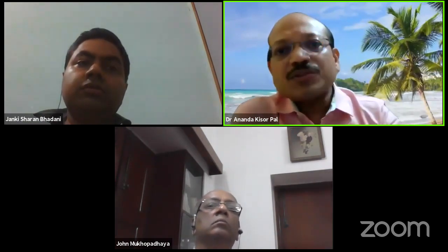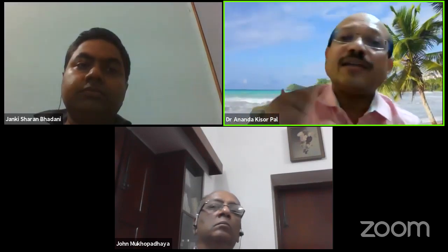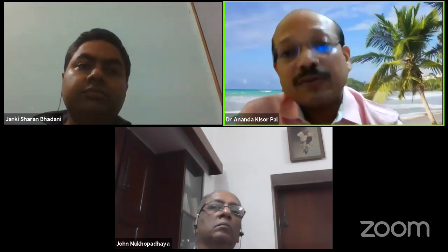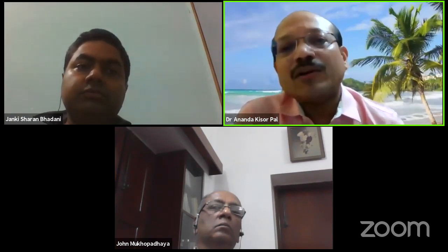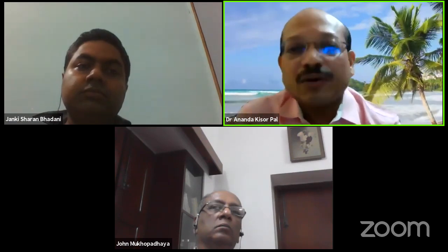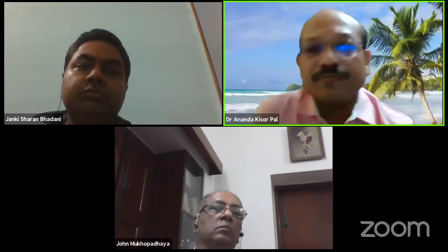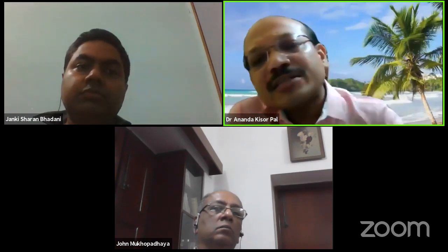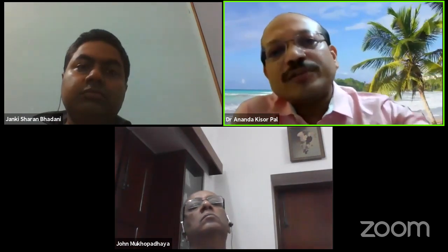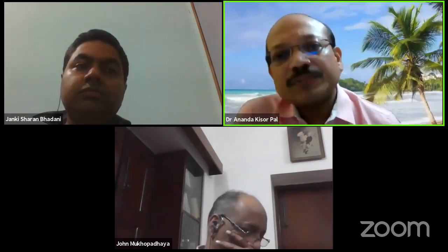Central stem. The central stem may be visible, and if you wrap the outside with some cosmetic material, it will look almost like a normal leg. So over the pylon, we can surround it with cosmetic materials so that it looks almost like a normal leg. The pylon basically connects the socket with the joint along with the ankle and the foot. Basically, the stem of the prosthesis.